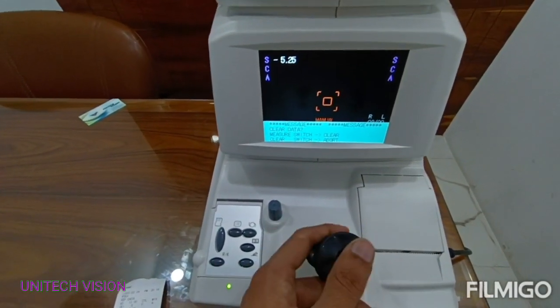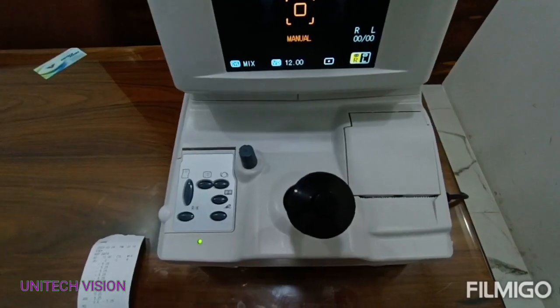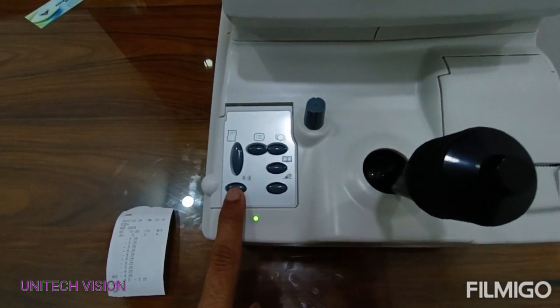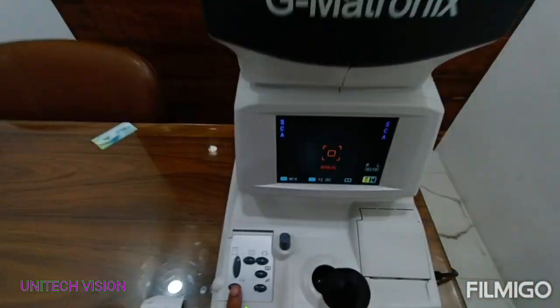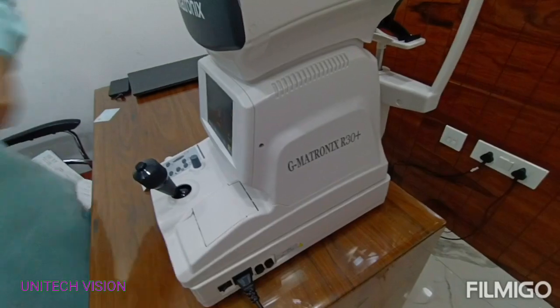Clear reading switch. R and K mode change button — this button will work on ARK, autoref with keratometer. This is the basic model: Autoref G-Matronix R30 Plus.